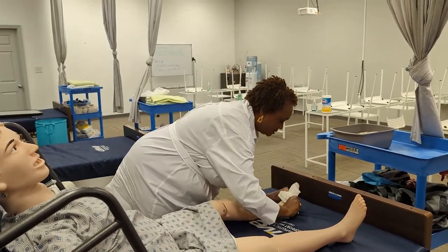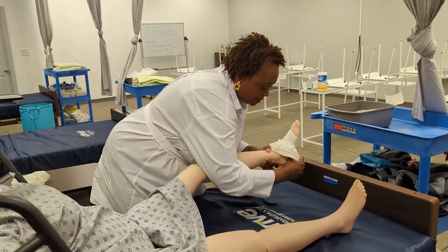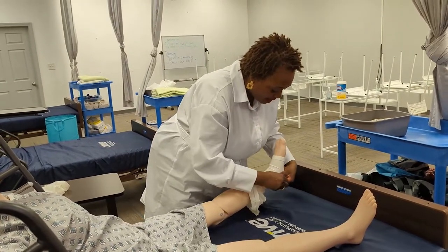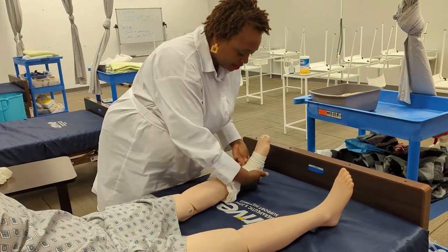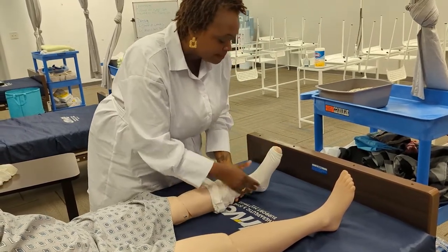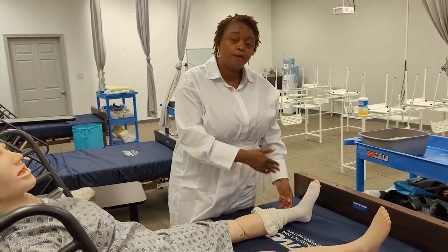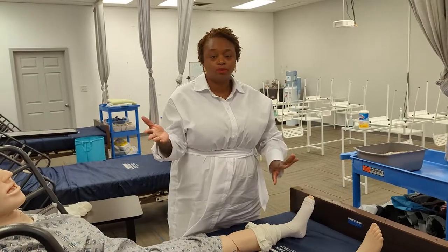I stretch the stocking and get it on the foot. If you get this first part on in one fell swoop, hold the joints — that's most important — and line up the heel. Some students rush to bring it up, but once I get it on, I make sure the heel is lined up, always supporting the patient's ankle. I smooth down below, making sure there are no wrinkles, because the stocking can actually ball up and form a tourniquet — it's so tight that when it rolls onto itself, the person's foot can turn blue.